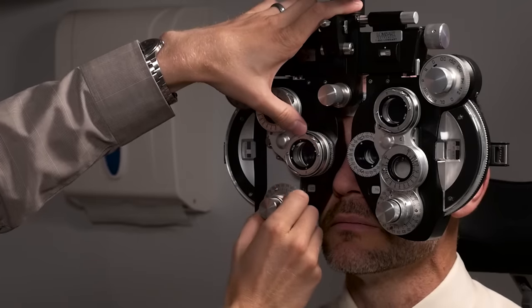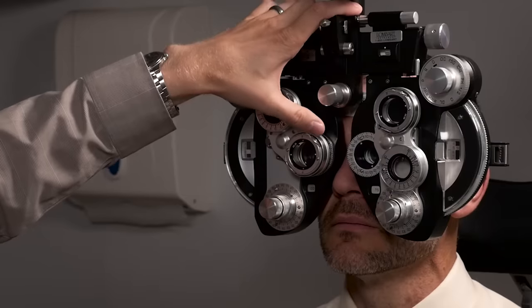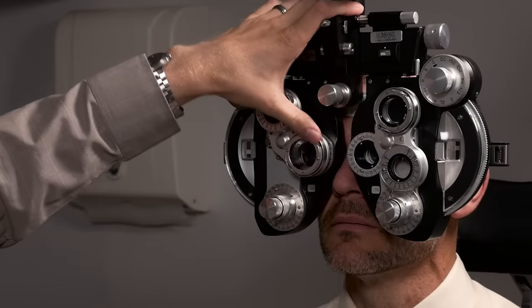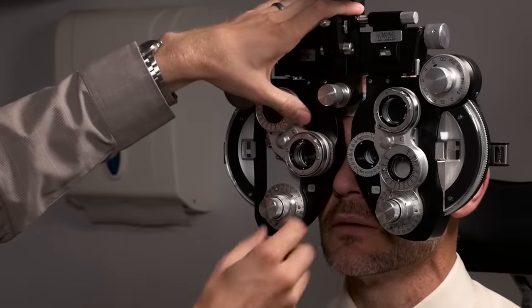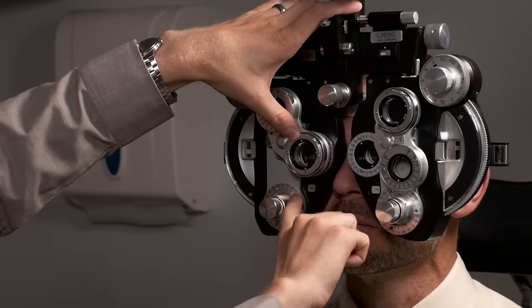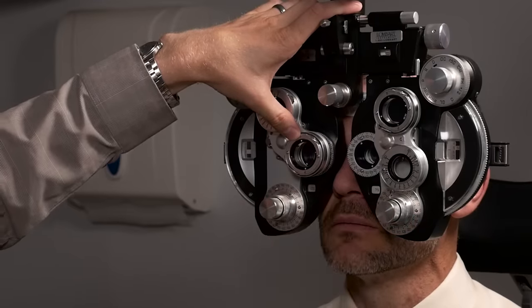Just to be safe I'm going to move it a little bit more in that same direction and ask him again what's more sharp and clear? Number one or number two? Number one. So we're going to go back to where we began here which is at axis 55. Based on his previous glasses that he walked in with or previous refraction or whatever previous prescription we have we know that that's pretty close to what he had before so we know we're on the right track.